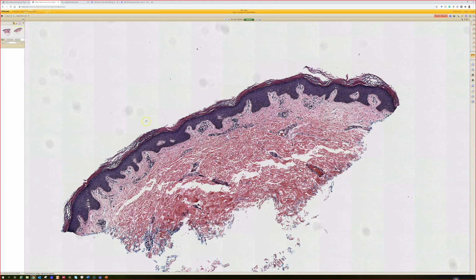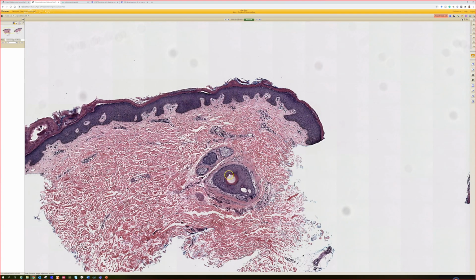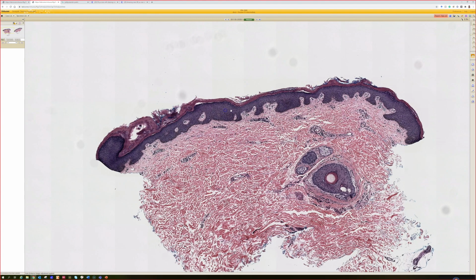It almost looks like acral skin a little bit, but we know it's not because it's got follicles. Although, admittedly, on the side of the hands, you can have hair there, and it starts to look acral. But you're right. This is a little acanthotic, and it's got a thick layer of compact ortho. That is such an important clue, not only for dermatophyte, but also for this disease.